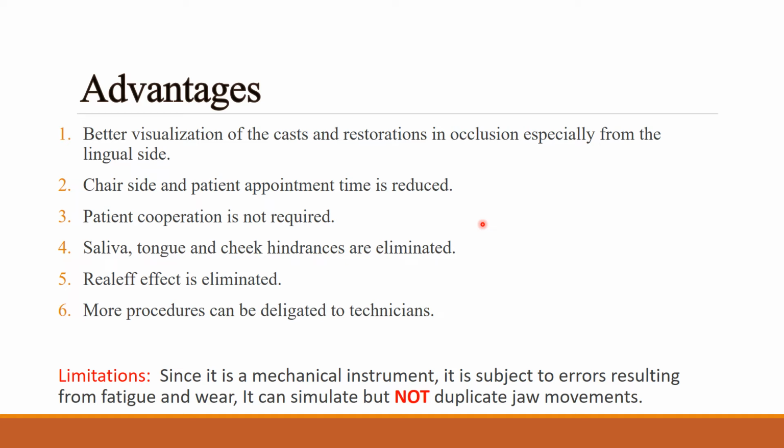So that's how we can appreciate this device immensely. Okay. Coming to the chair side and patient appointment time, which is reduced. Patient cooperation is not required because this is not in a patient's mouth. And saliva, tongue, and cheek hindrances are also eliminated. The reflex effect is eliminated. So the lifelike structures or resiliency in the tissues are also eliminated and not required.